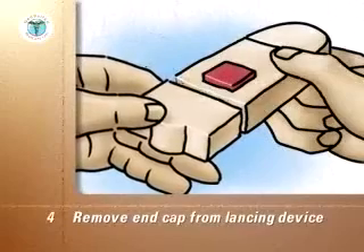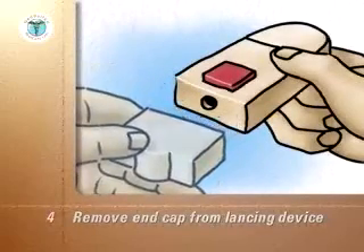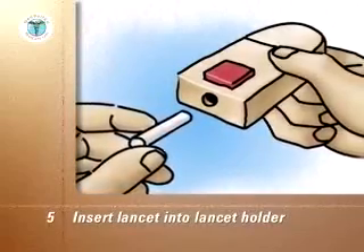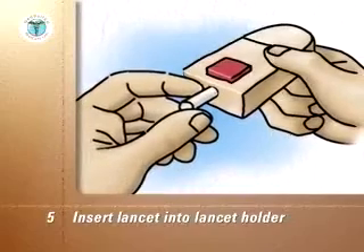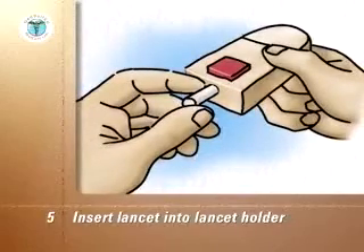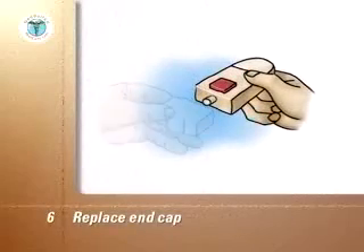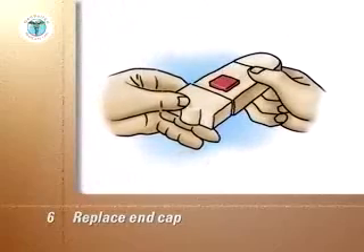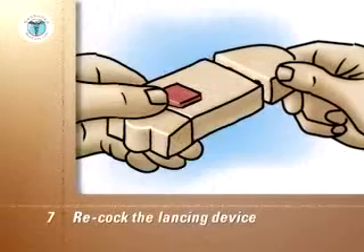Remove the end cap from the lancing device. Insert a short lancet into the lancet holder according to the manufacturer's instructions. Twist off the protective cap and save it for the disposal of the used lancet. Replace the end cap. The depth of the puncture depends on the end cap used. Re-cock the lancing device.